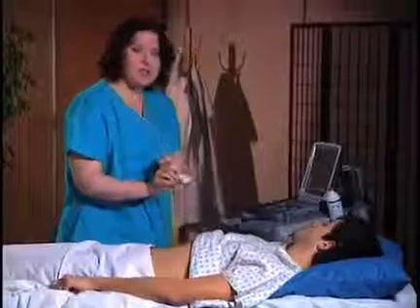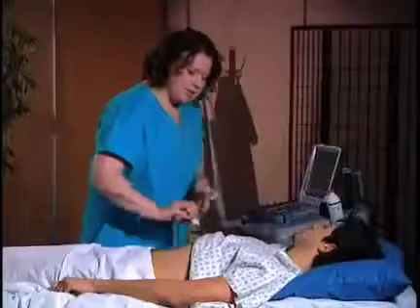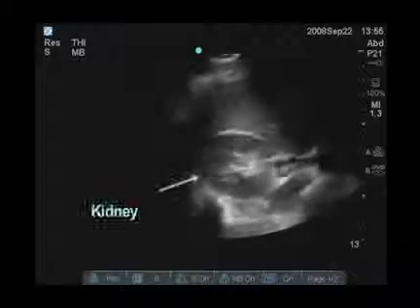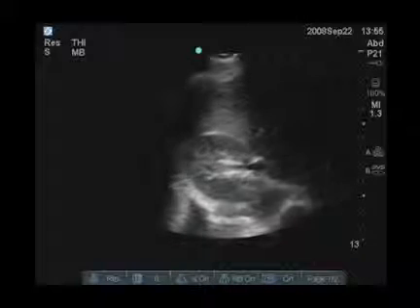Once I've finished the sagittal sweep, I'm going to turn the transducer so it's in a transverse view with the marker to the patient's right. Using the same window as I did for the sagittal view, I'll identify the kidney. It will now appear as a horseshoe shape, and we can see the renal vein coming into the pelvis of the kidney. I'm going to sweep superiorly until I move past the superior aspect of the upper pole, then sweep back down inferiorly, seeing the mid-level of the kidney, the renal vein, moving down a rib space, and into the inferior pole of the kidney. I continue until I do not see any tissue of the kidney anymore.